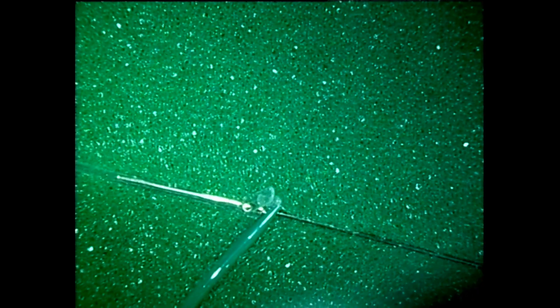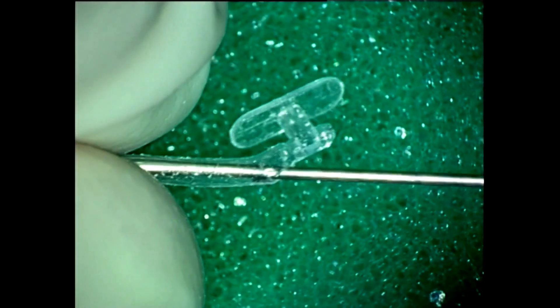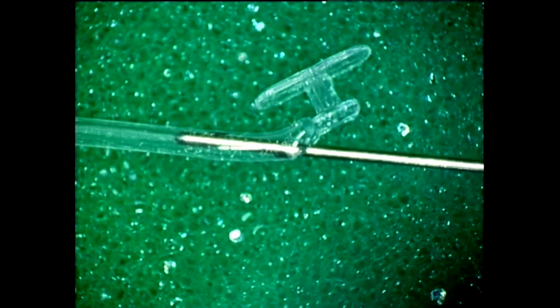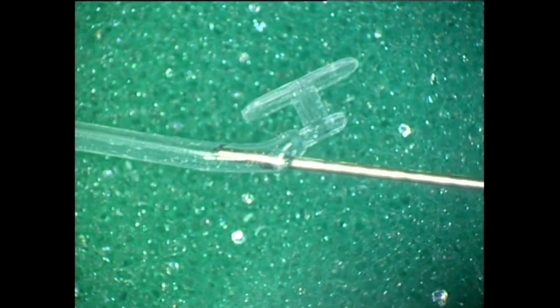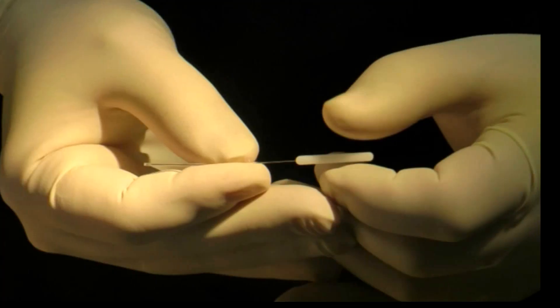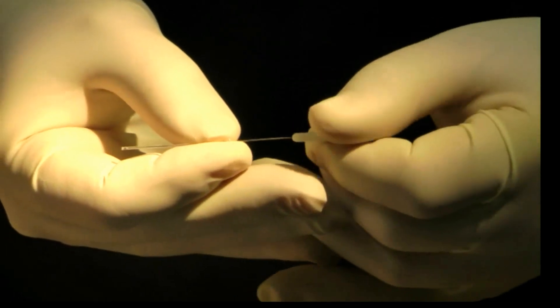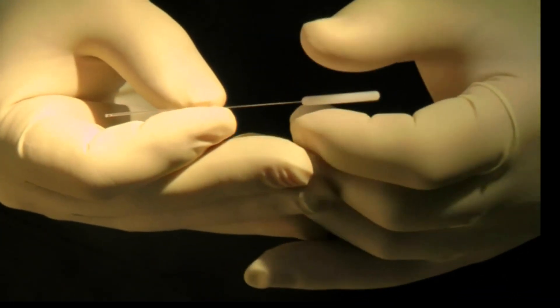Schematically, the principle of the Master Ka is comparable to that of venous catheters. The fixation plug is stabilized at the punctal opening by applying pressure with a blunt probe or the dilator insertion instrument to prevent the silicon tube from dislodging as the guide is withdrawn. It is actually possible to remove the guide completely and to reinsert it without altering the stability and shape of the Master Ka tubing.